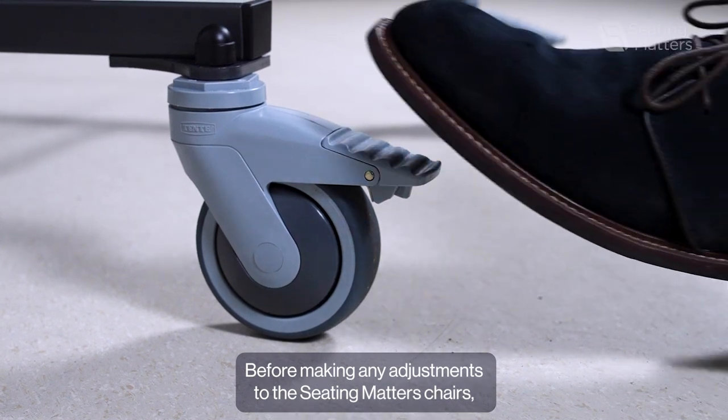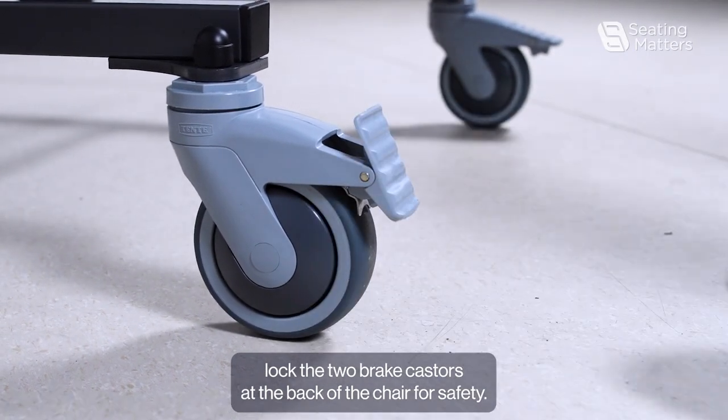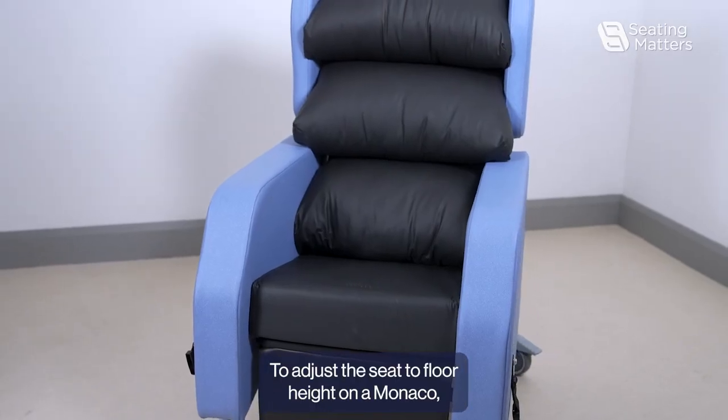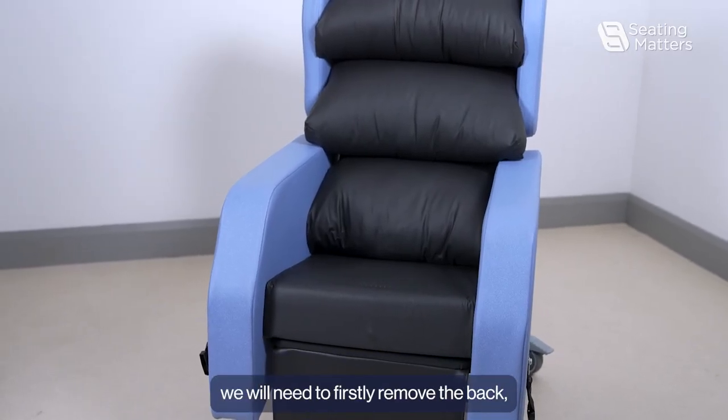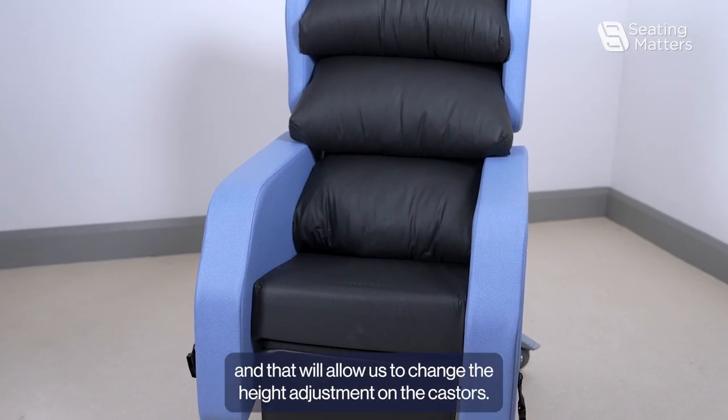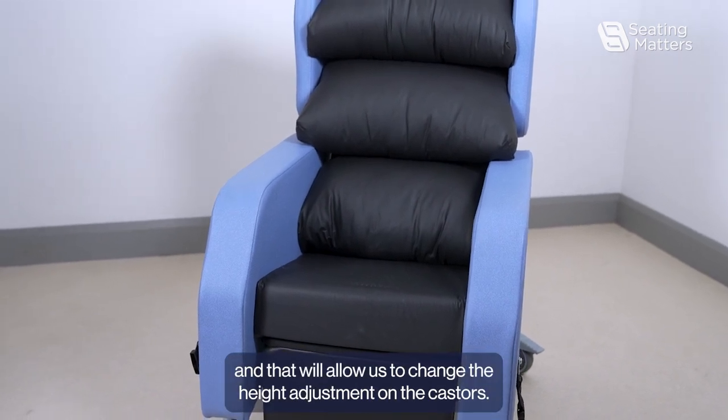Before making any adjustments to the Seating Matters chairs, lock the two brake casters at the back of the chair for safety. To adjust the seat-to-floor height on a Monaco, we will need to first remove the back, then remove the arms, and that will allow us to change the height adjustment on the casters.